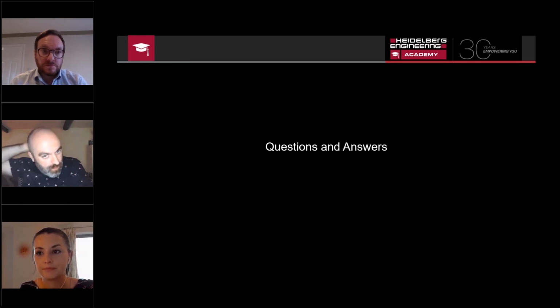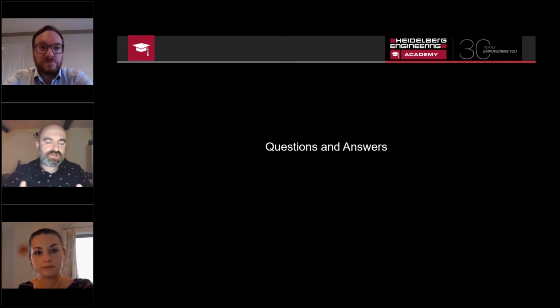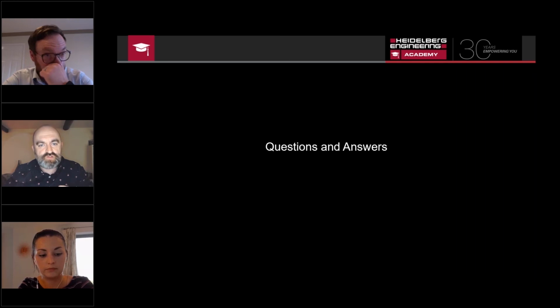Yeah, of course. Checking you've got the highest quality baseline scan really comes down to looking at the contrast of all the layers of the OCT. Can you see them on the scan? It's as straightforward as that, really. And has the segmentation done a good job? As I mentioned in my intro, that's the crucial thing before we go anywhere with the assessment, is double checking on that segmentation.